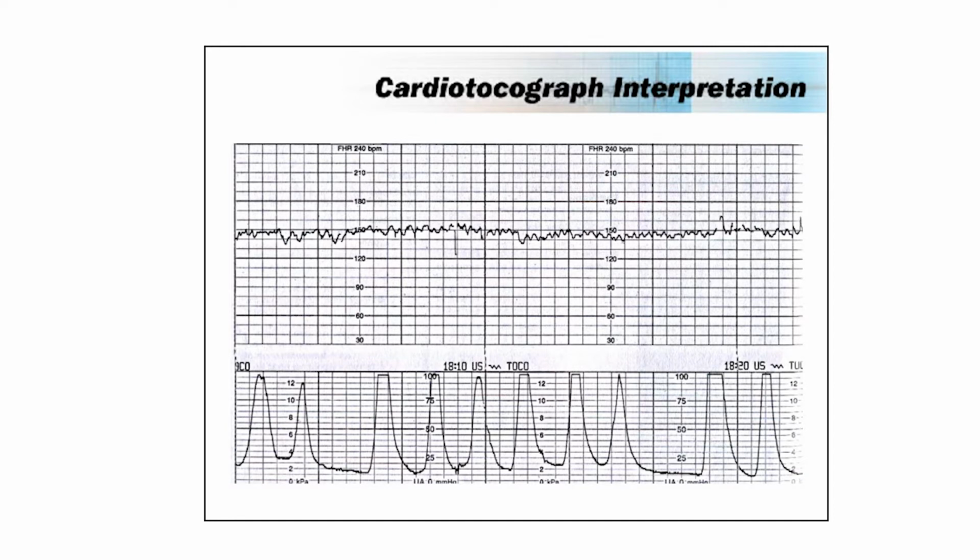Some people in the audience may say, I still don't buy this as true sinusoidal. And it doesn't really matter. The key is that if you think it may be, seek second opinions and do not ignore it. If you subsequently decide it's not a true sinusoidal, that's okay. But you've done something to confirm that it's not.